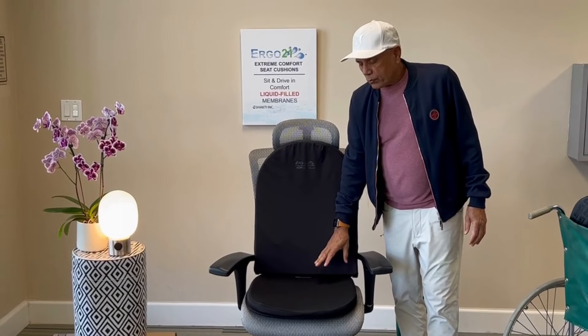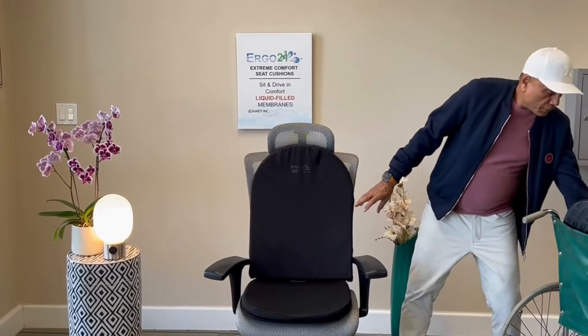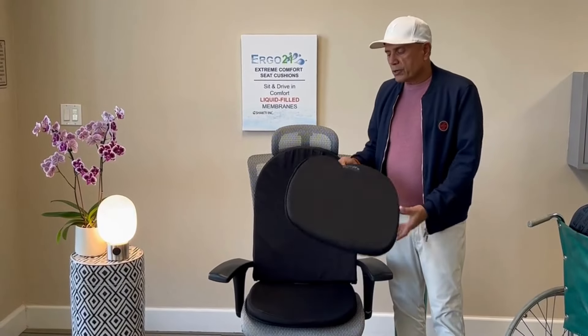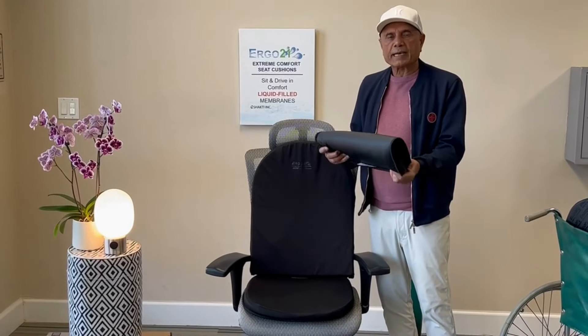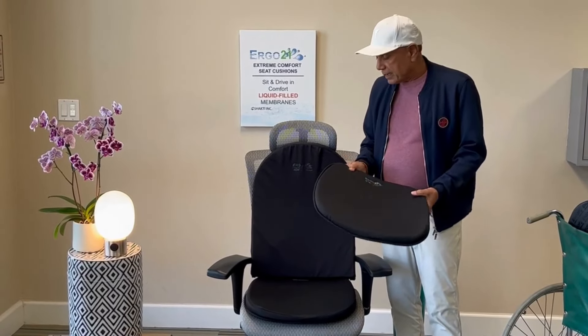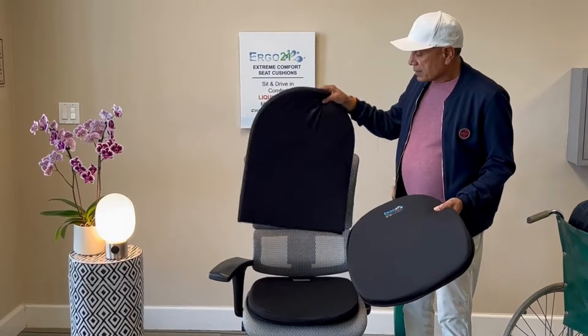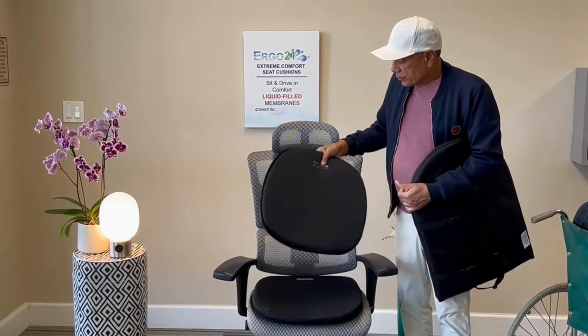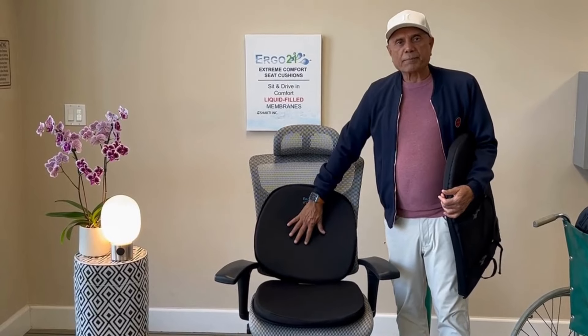Some people may want a thinner cushion — in that case you can use the travel cushion. The beauty of the travel cushion is you can take it anywhere: use it in a car, use it on a plane. If the cushion is too much for your bag, you can also use the travel cushion as a back support.